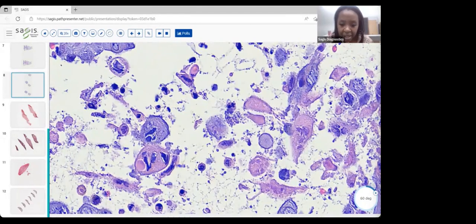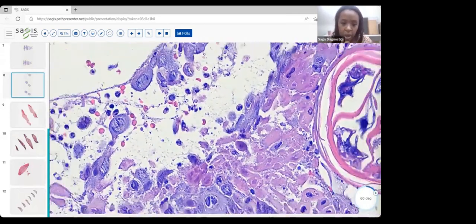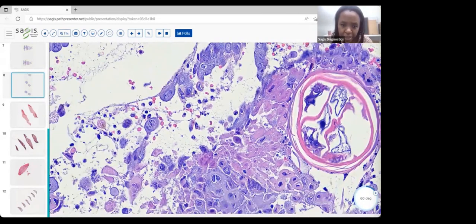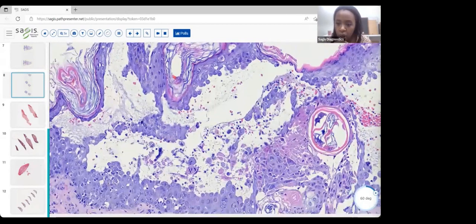And then finally, looking at the nuclei, there's a bit of a pattern that we tend to see. I'm going to try and find the best examples I can of this. This may be a good one. Okay, so you have the nuclei right there, dense and blue, but the chromatin, instead of being central, is kind of clumping at the edge of the nucleus.